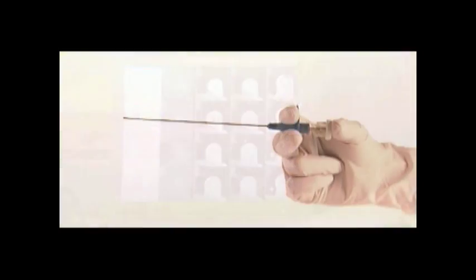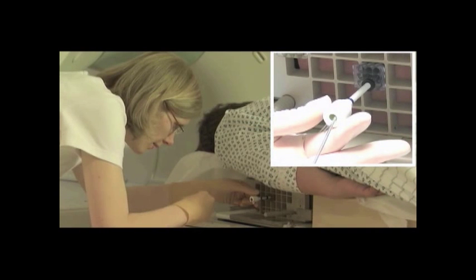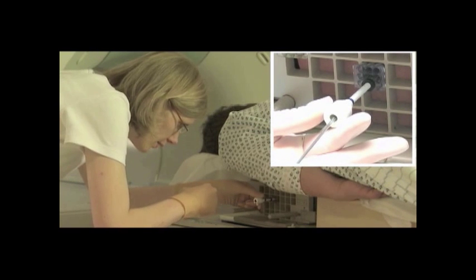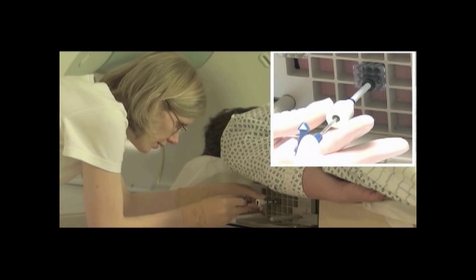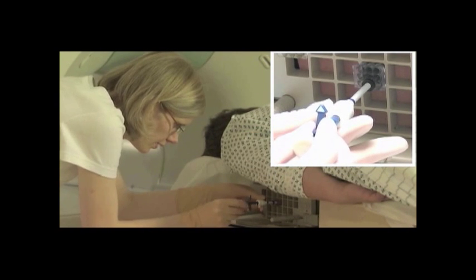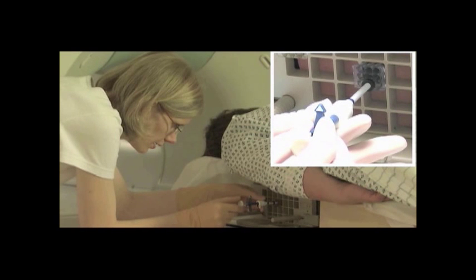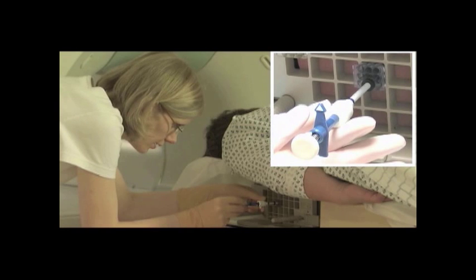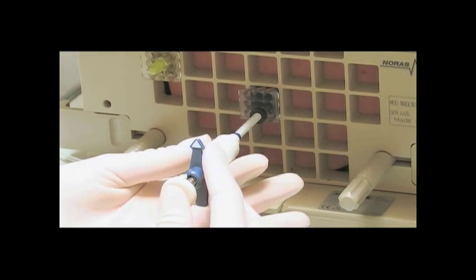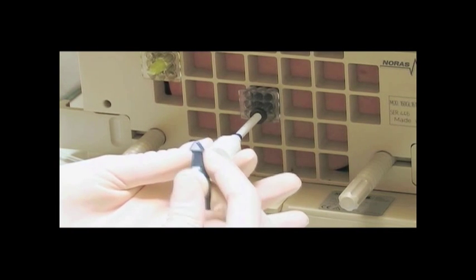You are now ready to place a biopsy site marker. The Atec TriMark biopsy site identifier will be used for this demonstration. Remove the localizing obturator and place the marker deployment device into the introducer sheath until the aperture indicator contacts the introducer sheath hub. To make sure this position is maintained throughout the deployment of the marker, hold the device in place with your free hand. Deploy the marker by pressing the plunger with your thumb. An audible and tactile click will confirm deployment.